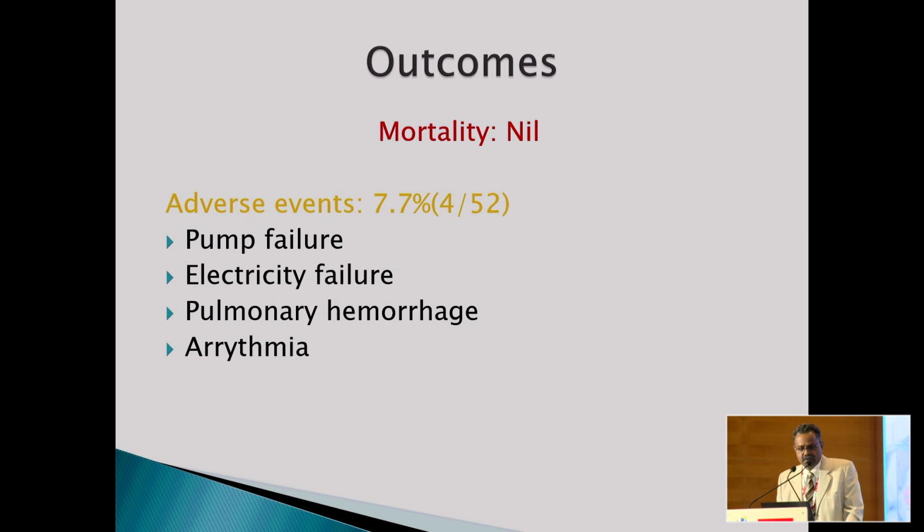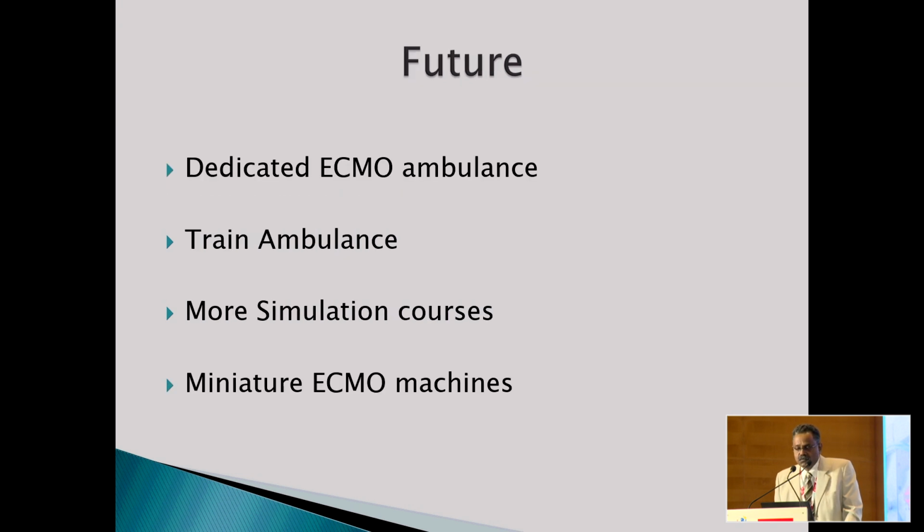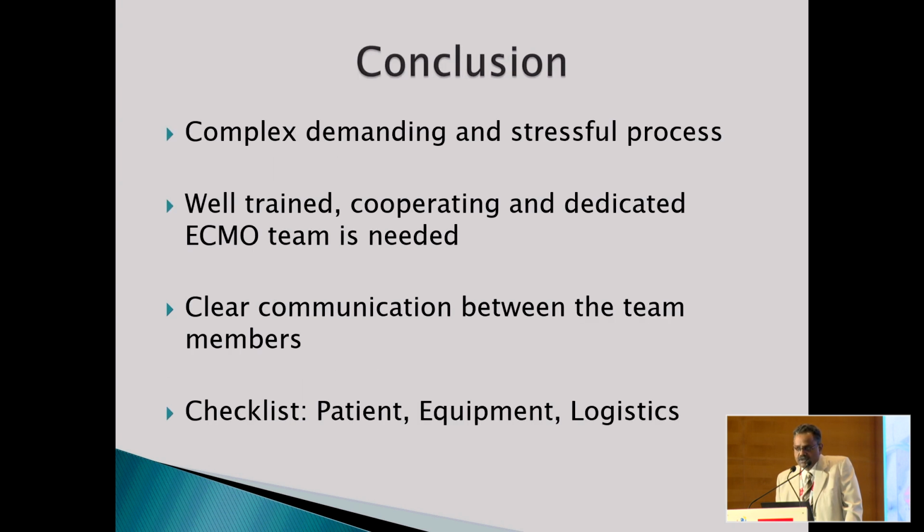Then we transferred the patient back here. So for the future of transfer ECMO, a dedicated ECMO ambulance is mandatory to manage these kinds of sick patients. A train ambulance is one of the choices through which ECMO patients can be transferred without much jerks and hazardous roads. More simulation courses are needed. Miniature ECMO machines may ease our transport.